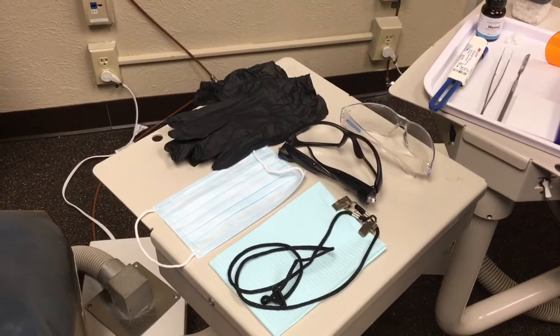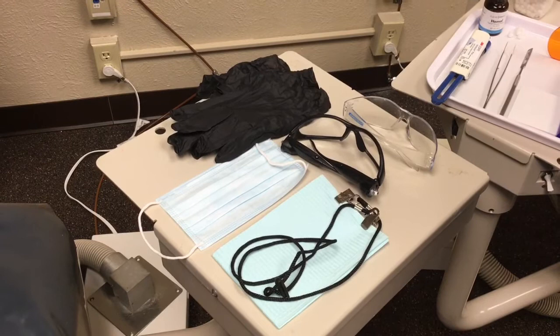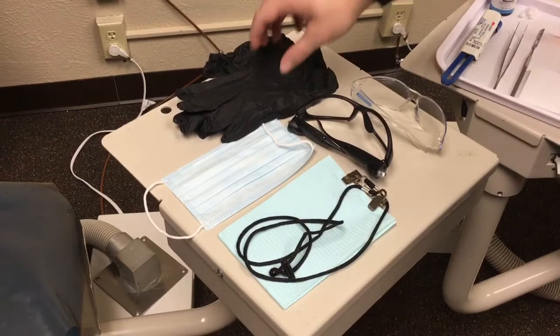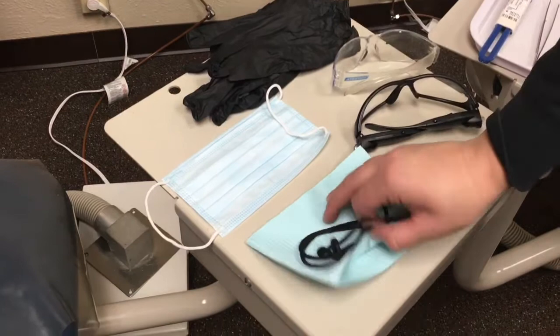Hi and welcome to the tray setups for a composite restoration. Right now we're set up for a class one, which is a posterior occlusal, or we can do a class five, which is either anterior or posterior on the cervical third of the buccal, facial, or lingual. To start out with, we always want to make sure that we have our PPE: a pair of non-latex, non-powdered nitrile gloves, our face mask, two sets of glasses — one for you and one for the patient — a patient bib and a patient bib clip.